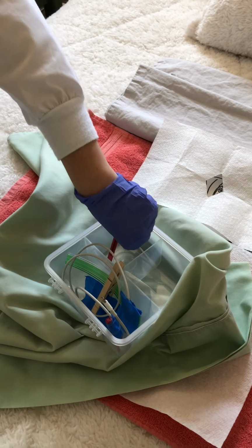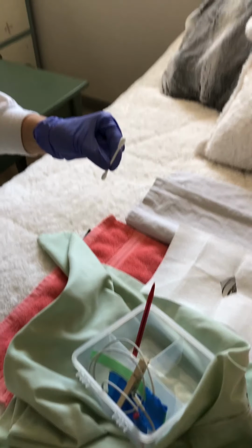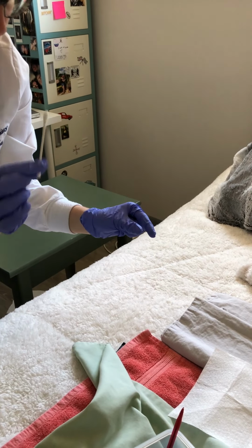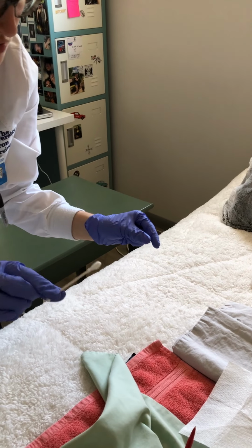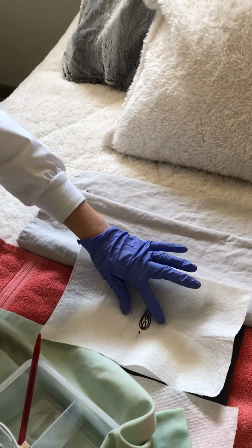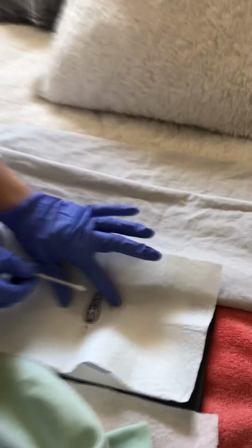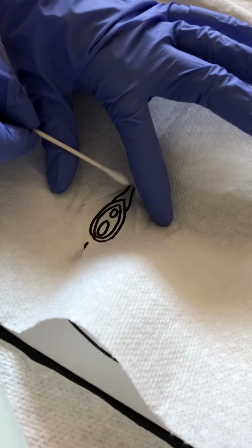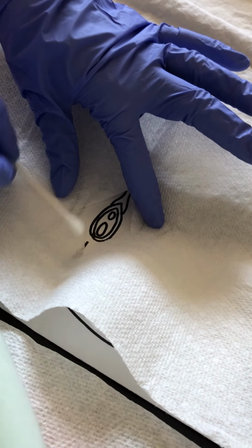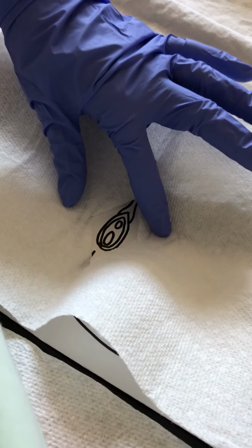I am then going to grab the Betadine swab, and I'm going to use my dominant hand to do the wiping, and my non-dominant hand to spread the labial folds. Again, just as we wiped with the cloth before, start at the top and go down to the rectum. I would dispose of that, and then again clean the outer, dispose, and then dispose, okay?